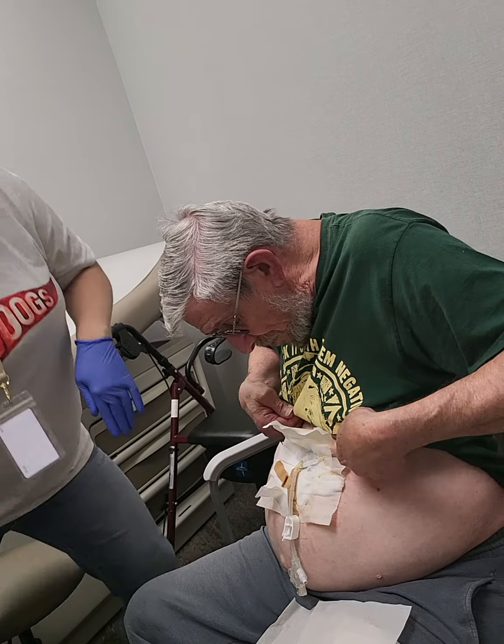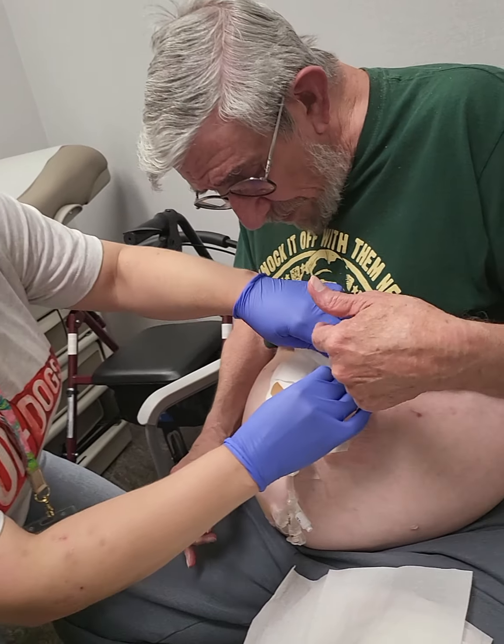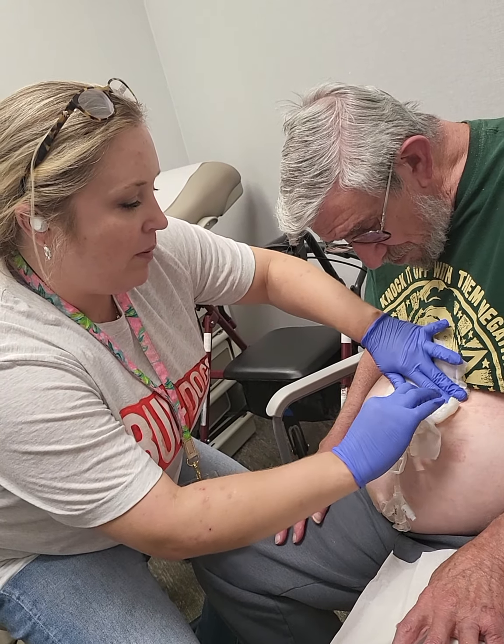You can shower and just clean your skin with normal soap and water. You just want to make sure everything's dry before you put the gauze on that I'm about to show you.